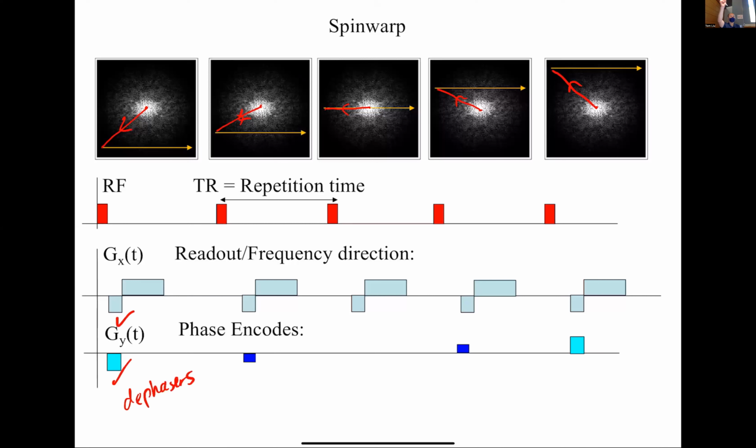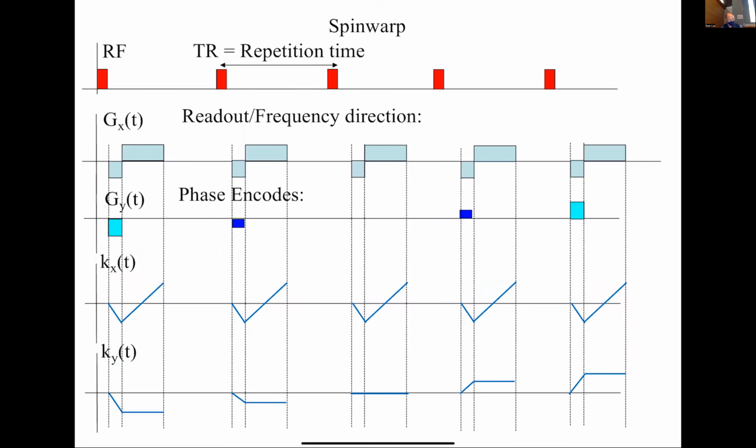They basically take you out to some point in K space, and then this is really where the readout occurs, and that just zooms across K space. So what does it look like in K space? Now we're repeating that, and showing where you are in Kx as a function of time. We go out to some negative value of Kx, and then linearly increase and cross Kx with the rest of the time.